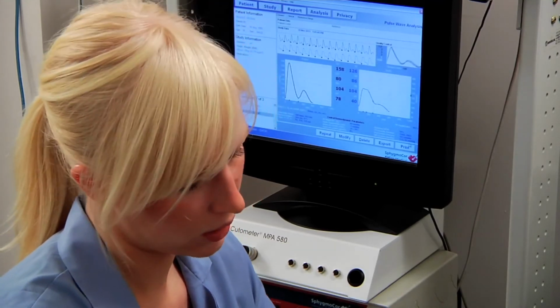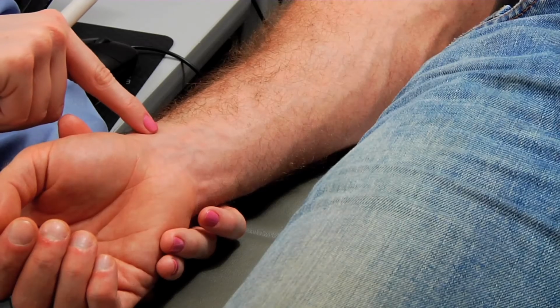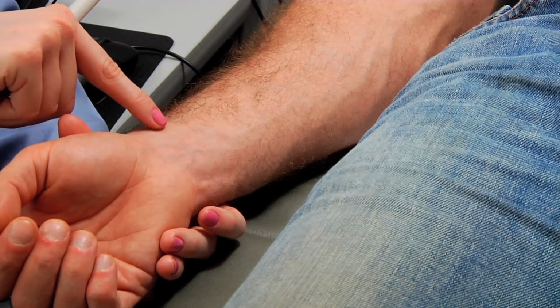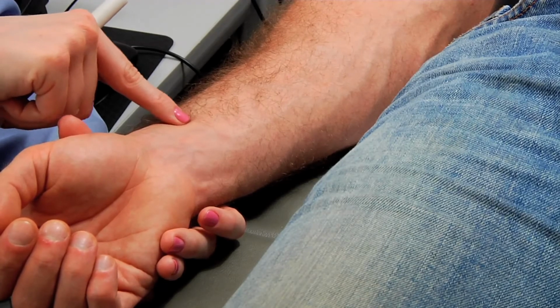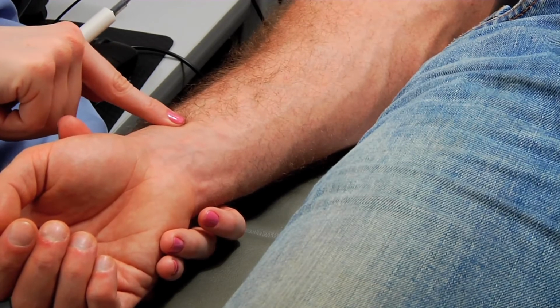So what you'll want to do, instead of placing the probe up here close to the joint of the thumb, is move down the artery to a little bit further down where it's embedded a little bit further and it won't be quite as strong.